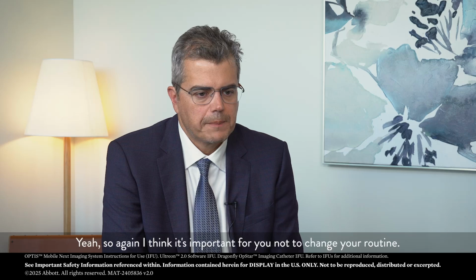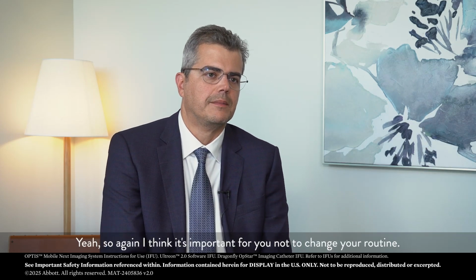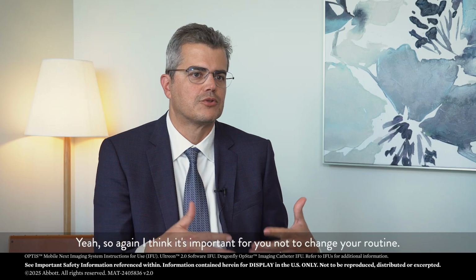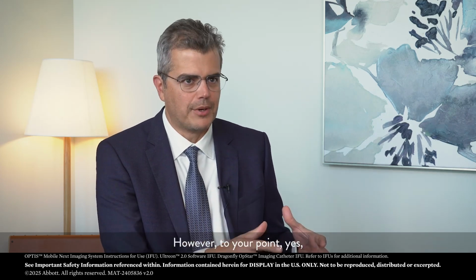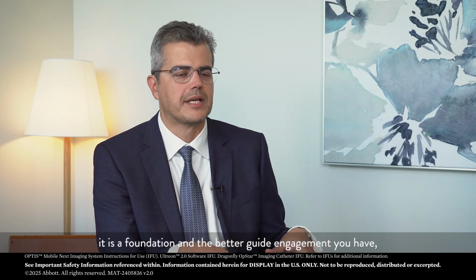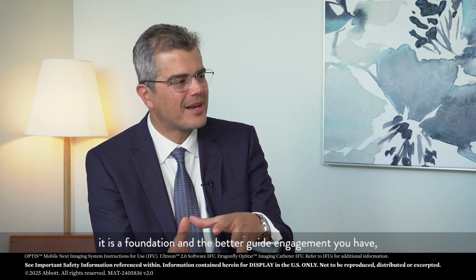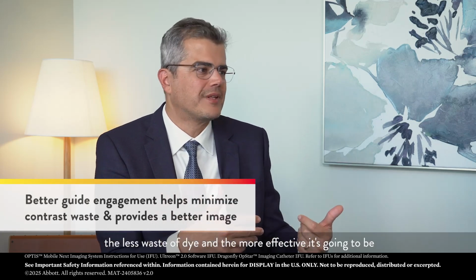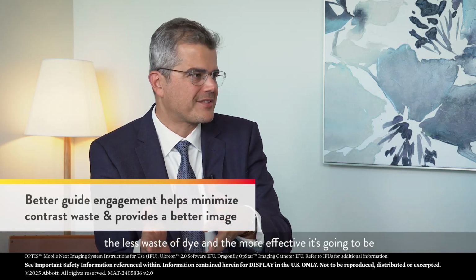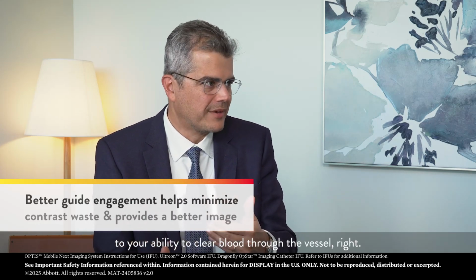Yeah, so again, I think it's important for you not to change your routine. However, to your point, yes, it is the foundation, and the better guide engagement you have, the less waste of dye, and the more effective is going to be your ability to clear blood through the vessel, right?